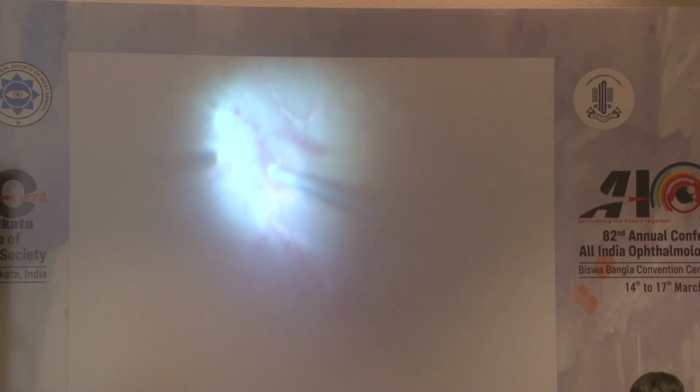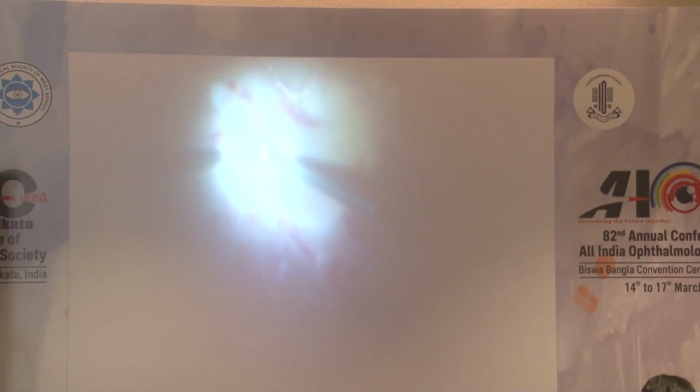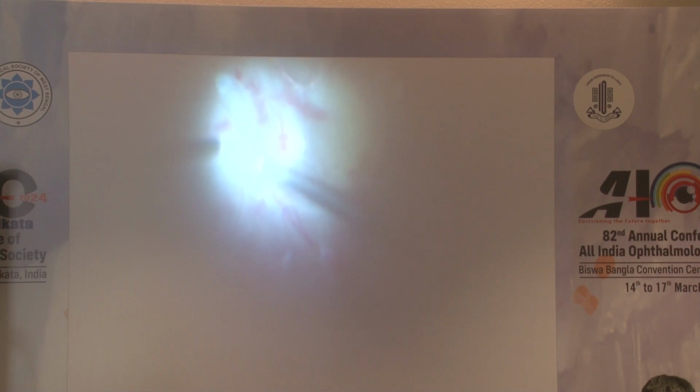Here, post the triamcinolone wash, in the inferior area where the tractional retinal detachment was present, we notice that there's a little amount of fibrin admixed with a little amount of posterior cortical vitreous which can be easily pulled off with the help of your vitrector. We can now see that the vitrector has removed all of the traction by massaging the retina gently.